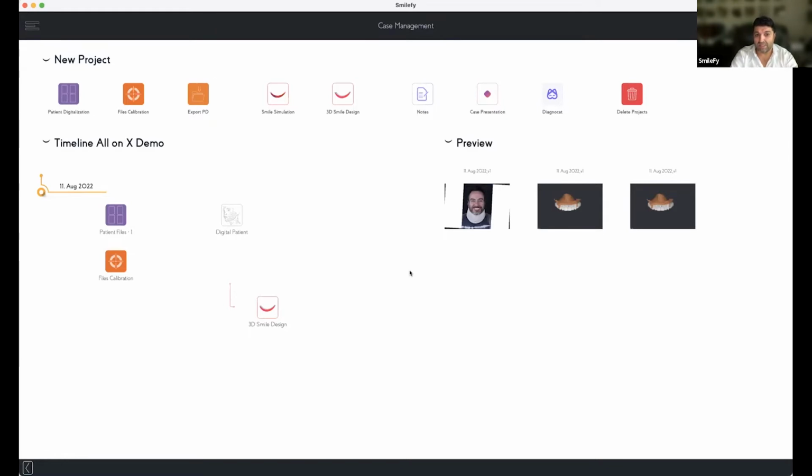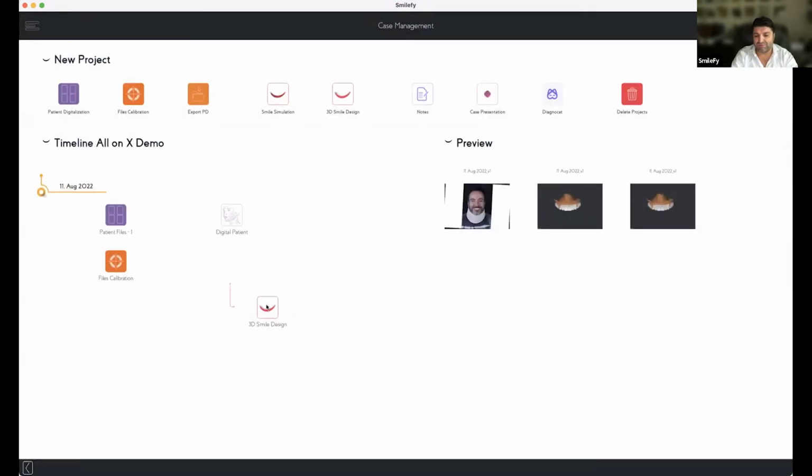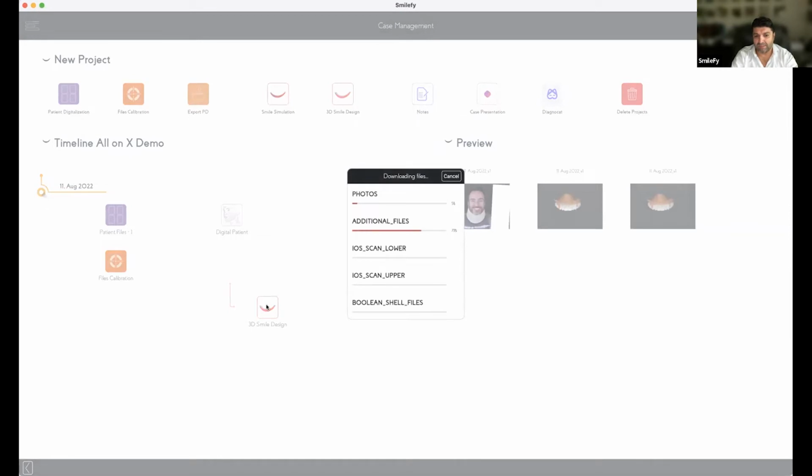So that's the workflow of the full arch implant bridge. I had a very interesting discussion with Professor Alessandro Pozzi from Rome. He's also a very passionate researcher and dentist and surgeon. And what I didn't understand actually is that we are so close to just adding the connector for the teeth and not using, for example, in some cases, the prosthesis gingiva.